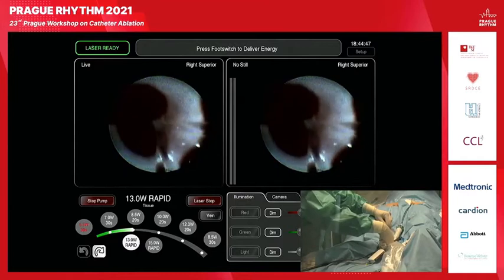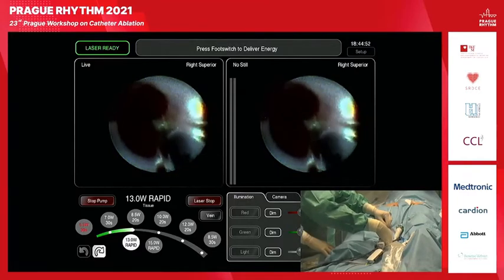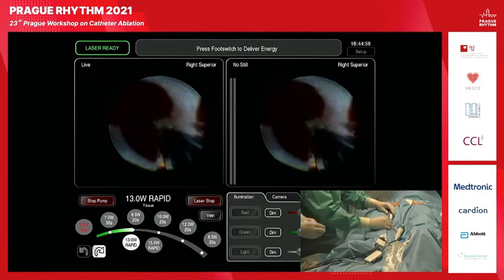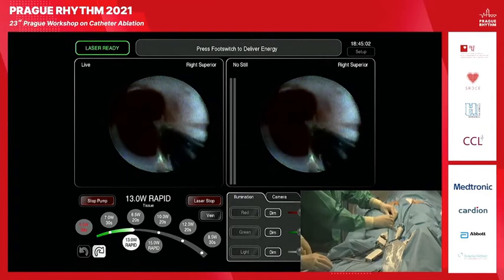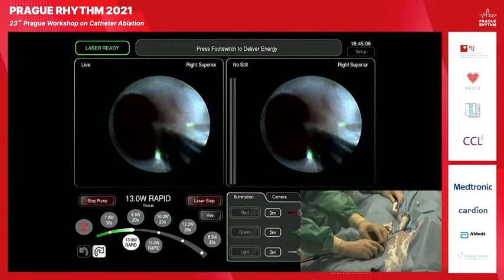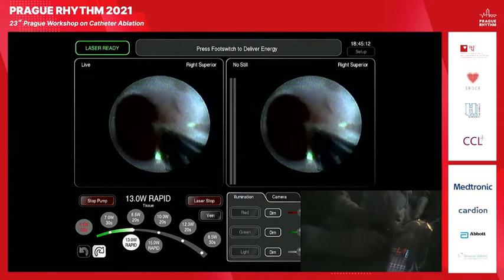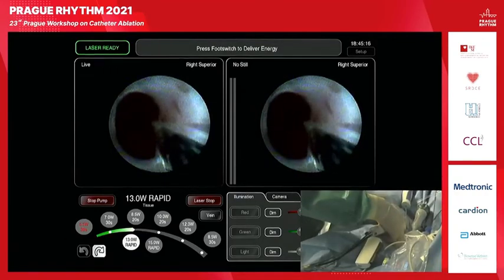So I will play with the beam. Actually, can I get this? Okay, perfect. It's a pedal you can control, and we will start hopefully with... Can we go up? Okay, perfect. Nice. Can you go less slide, guys? Okay, it's too much. So we can go even behind the shaft. Okay, and let's start, counterclockwise.